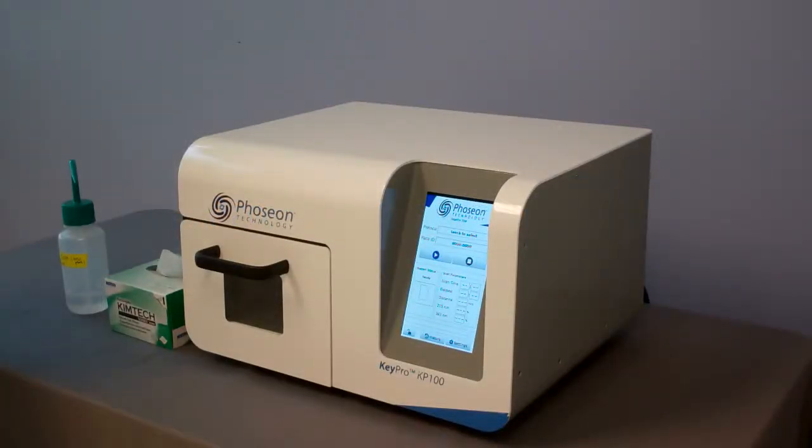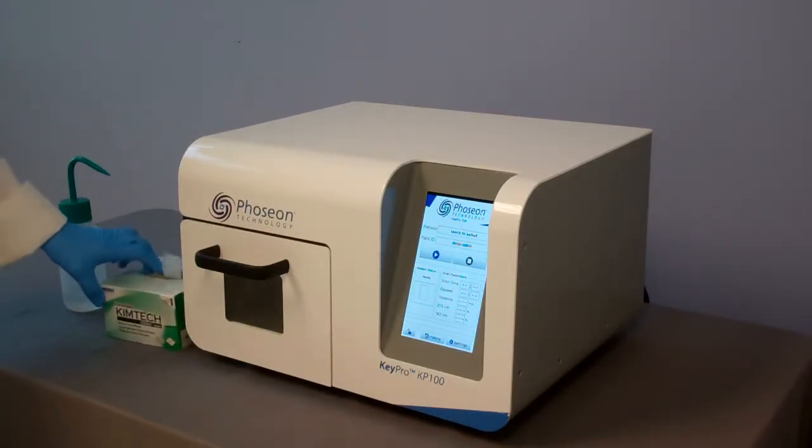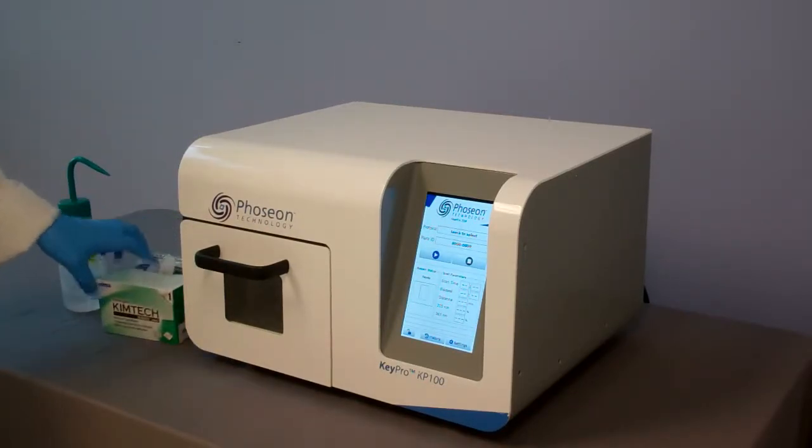To clean the KeyPro decontamination system, use any non-abrasive laboratory cleaner and a new or clean lint-free absorbent towel. If you clean the emitting window, make sure you use either pure, deionized, or HPLC water, or HPLC grade ethanol.